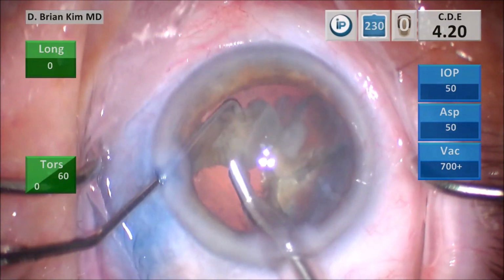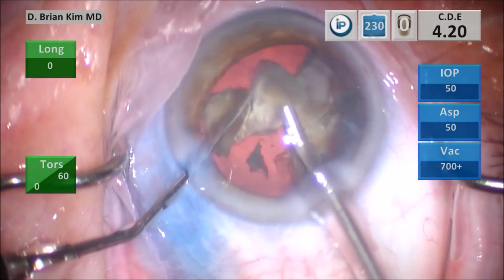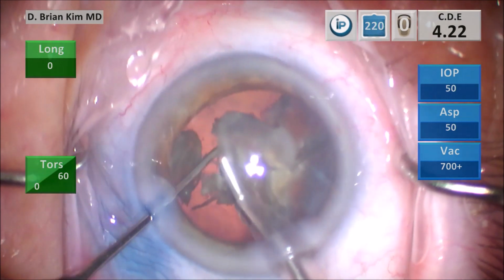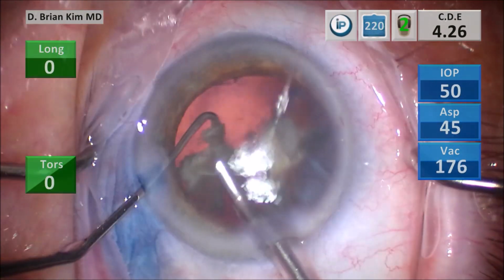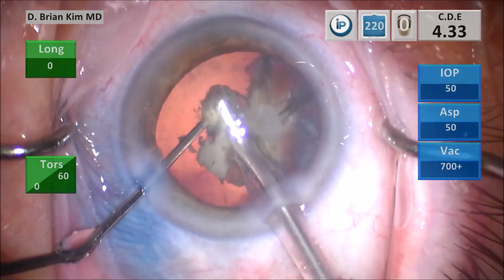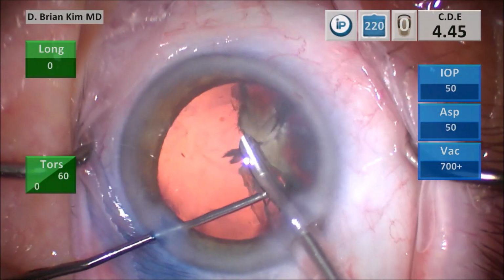Using a little vacuum to grab that other piece, it's a much bigger piece, and then sandwiching it between the chopper and the phaco tip, and just doing successive mechanical fracturing forces, again, crushing the lens piece between the chopper and the phaco tip over and over again until it's smaller, and then emulsifying the lens piece. Using some vacuum to grab that other endonuclear piece, crushing it between the chopper and the phaco tip, mashing it, and then emulsifying the lens piece.